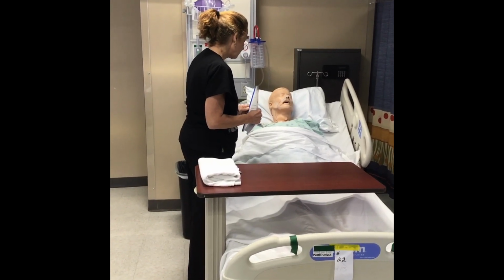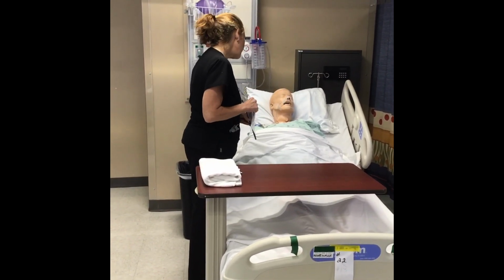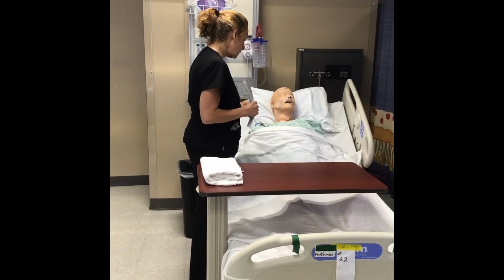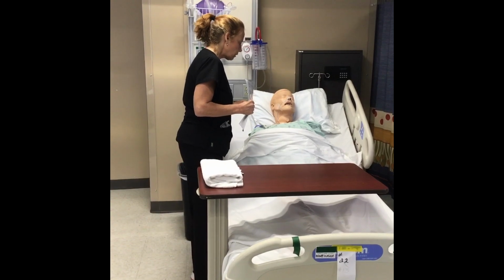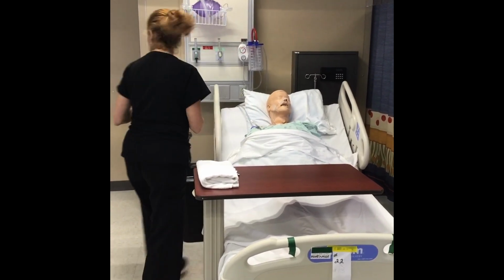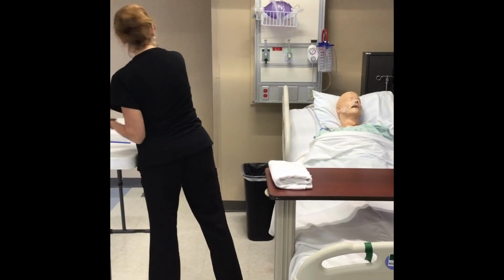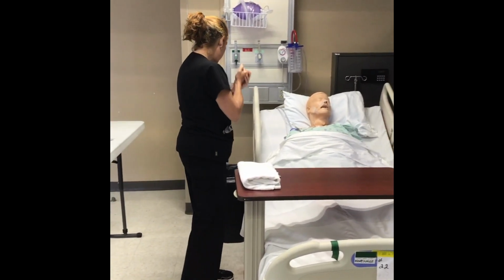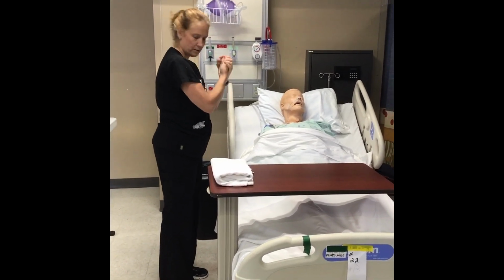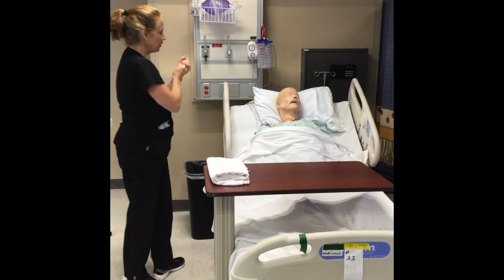Do you have any questions, or is it okay if I proceed? How long will this take? It'll probably take about 5 minutes, no more than that. Good. Are you expecting any family to come anytime soon? I don't think so. Okay, then let's get started. How does that sound? Good. I'm just going to put some gloves on and proceed, okay? Was the family pretty compliant with keeping the bed at 30 degrees while you were here? Oh yes, we didn't have any problems. Good.